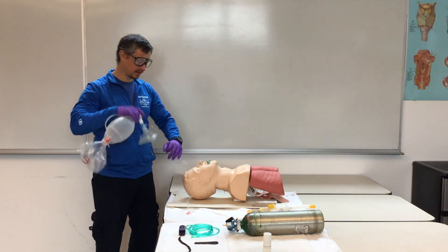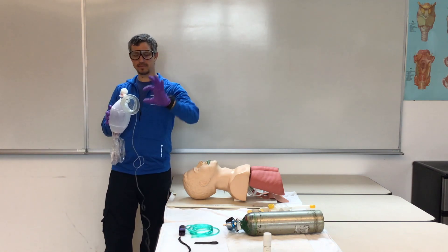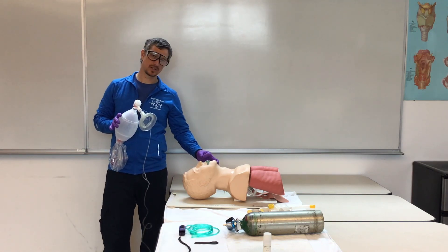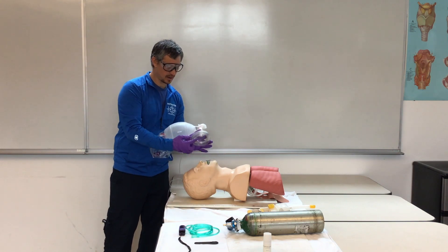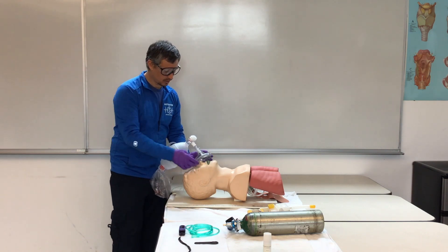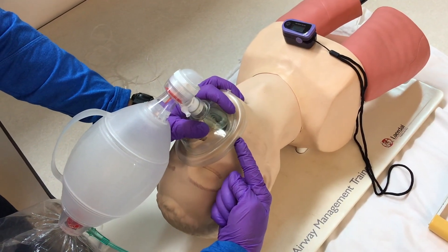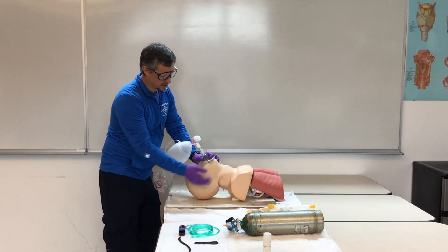When we attach the mask to our patient's face, we're going to use what we call a C-E grip. We make a C with our index finger and thumb around the mask, and then our three fingers create the letter E to go under the patient's jaw. We need a good seal — common fail points are the bridge of the nose and the corners of the mouth, so take that extra second to ensure the mask is sealed. Lift up with your three fingers in the E grip with a head tilt-chin lift.